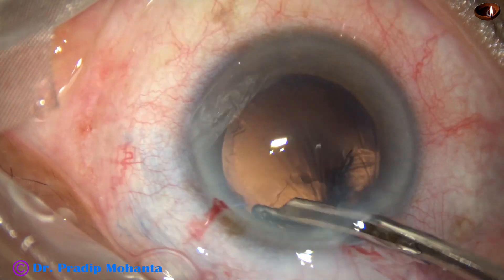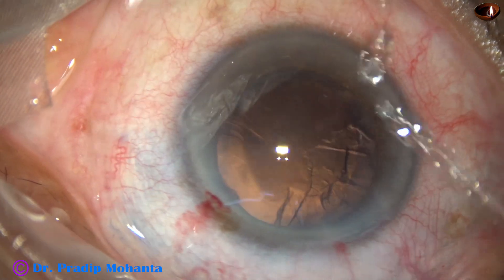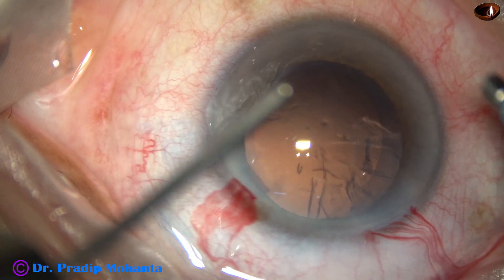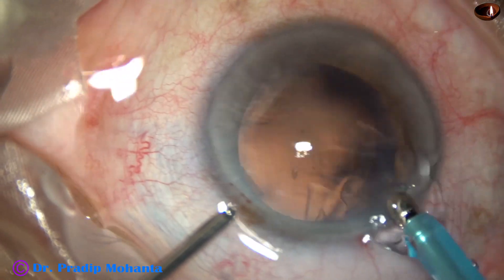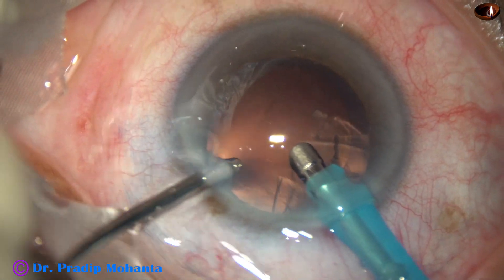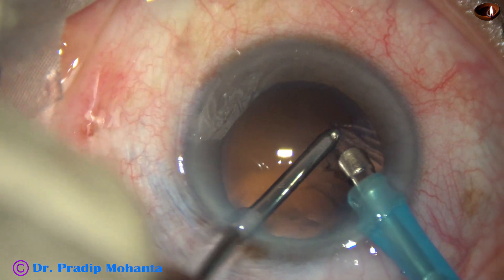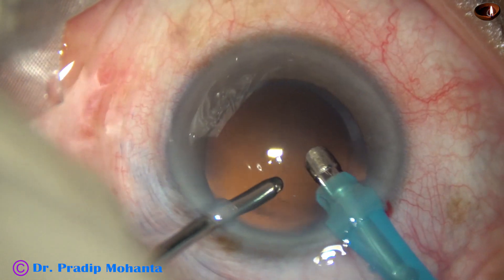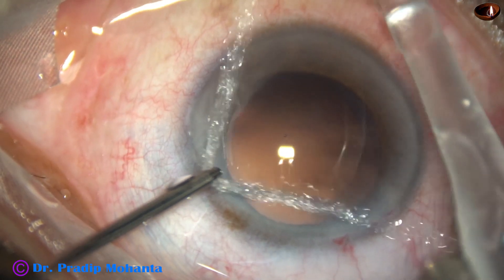The side port is small and the Simcoe will not go through it. So we do Hybrid IA again — the aspirating port is capped, aspiration is through the side port by the aspirating cannula, irrigation is by the phaco handpiece, and the sub-incisional cortex is easily aspirated.